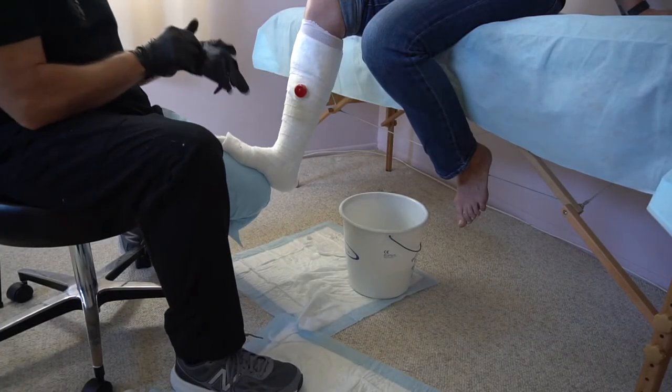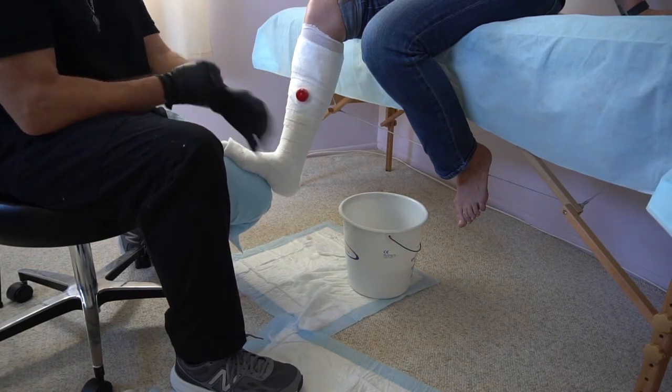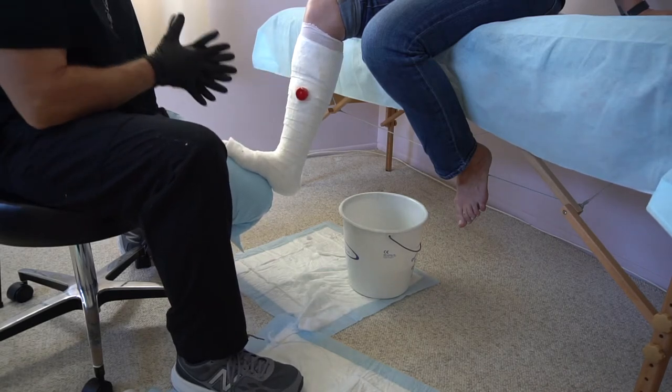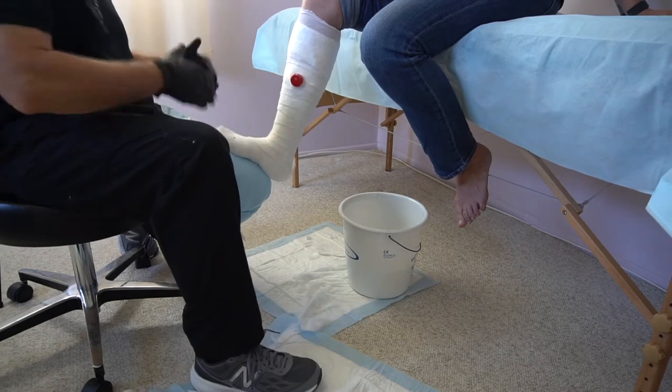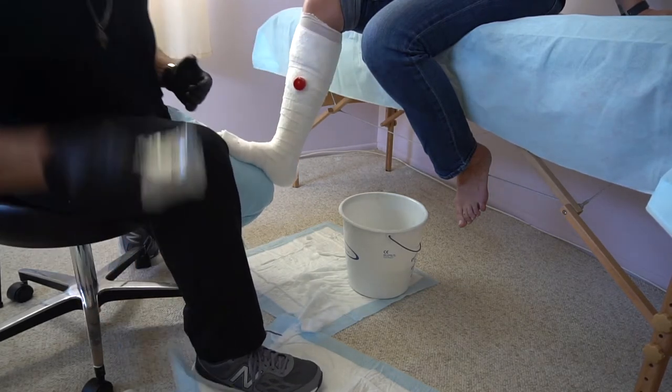I prefer to double glove now that they no longer put powder in them, so that when I'm done with the base layer and ready to move on to the second layer of fiberglass, I don't have to fight getting those gloves on. Just pull the top layer off and keep going fluently, since the timing is set for your fiberglass to harden.